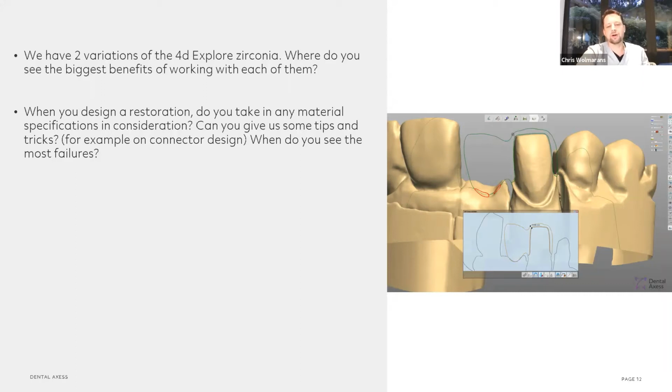I think a way to overcome this is for the dentist to understand this and to do adequate tapering so that you have a better transition from thick to thin to deal with the stresses. Mm-hmm. But when a dentist doesn't taper it enough, as we all know, we don't get the ideal preparations. Is there, in your experience, a different approach? Are you doing something different?